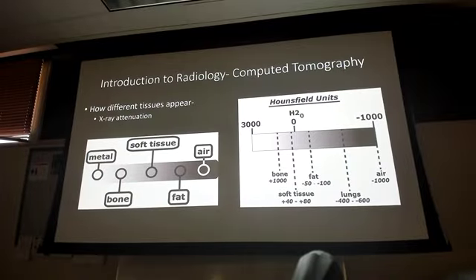if you're in the ER and you're trying to evaluate something and you're like, oh, I remember that thing, hey, let me pull this up real quick, and you pull it up, and then you use that as part of your, hey sir, I just got a CT scan back, there was this mass in the liver, but I went ahead through the hospital, you just looked at it, it looks like it's a cyst because it's around 0 or whatever, and you just earned bonus points for knowing what the heck you were doing without having to be taught that. If you can have this kind of at the ready and go.